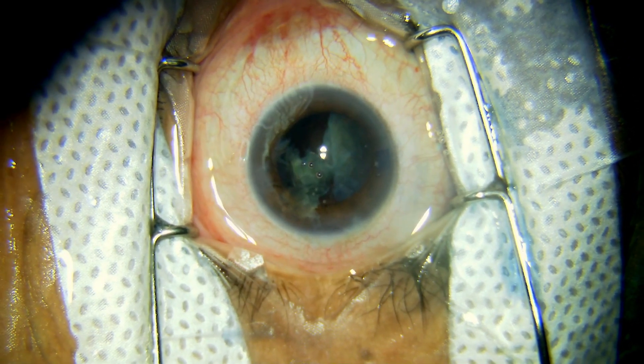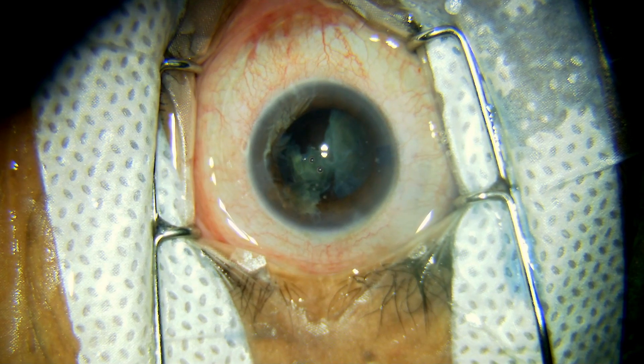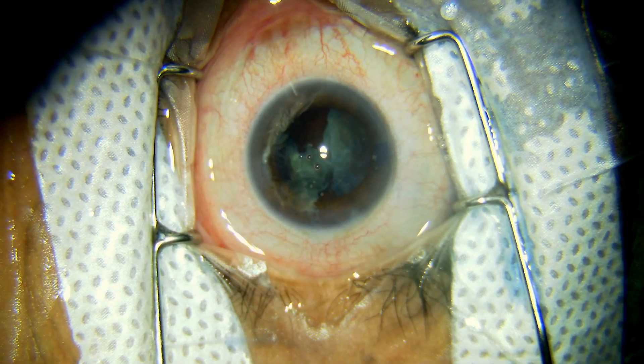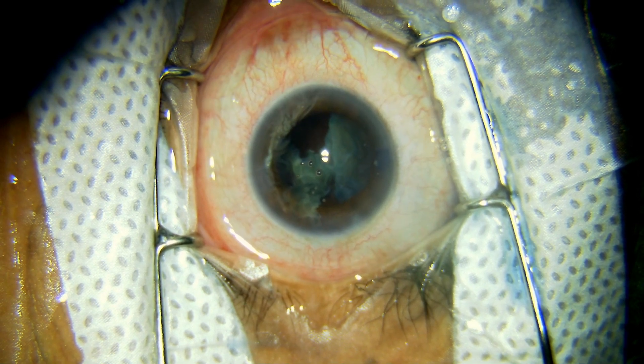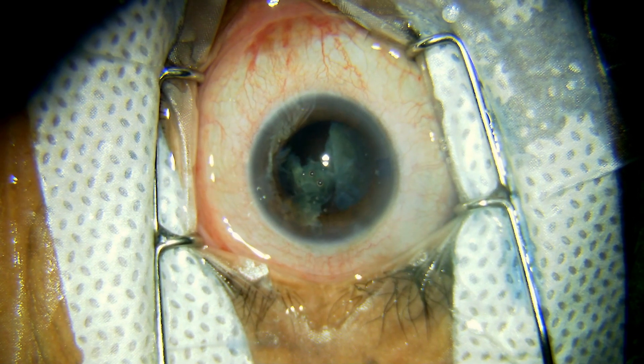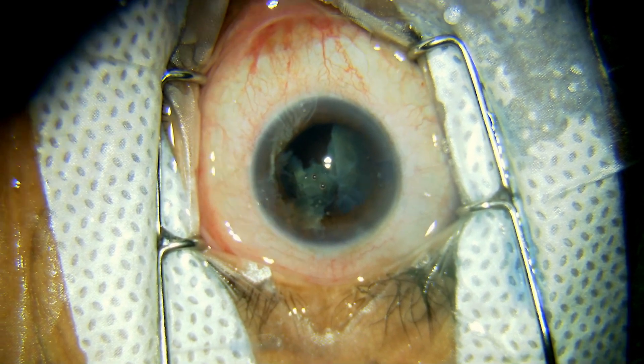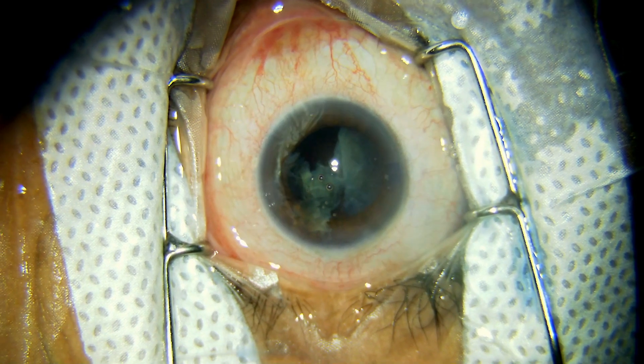There is a small rent in the nasal quadrant which is noticed at this juncture. More than one half of the nucleus is still in the bag.